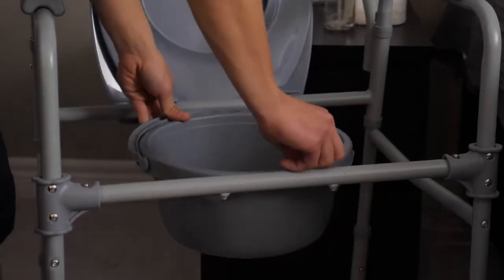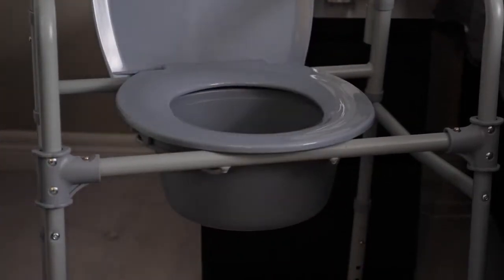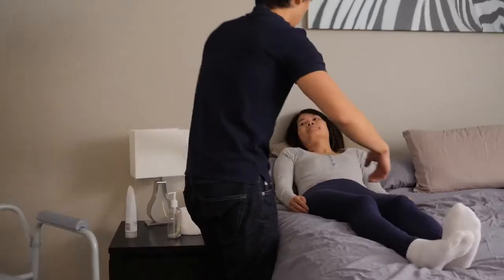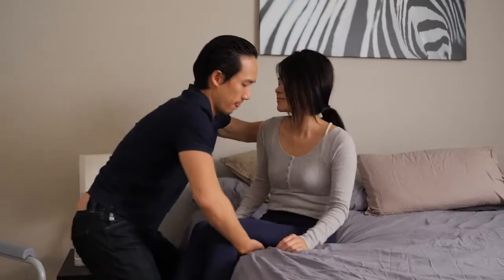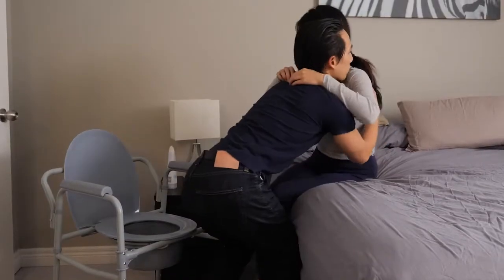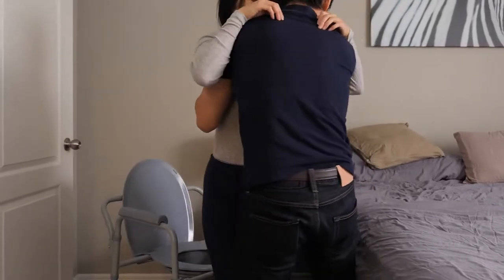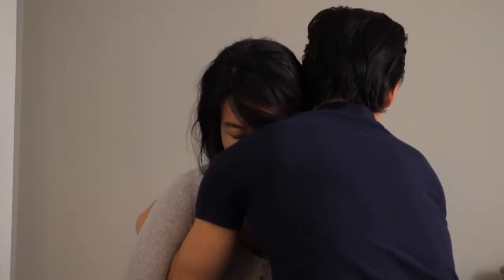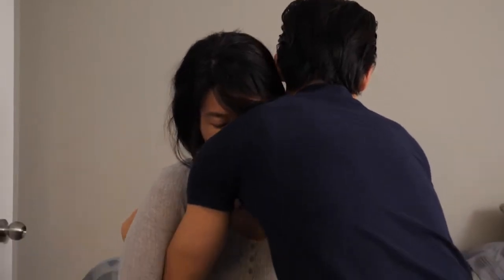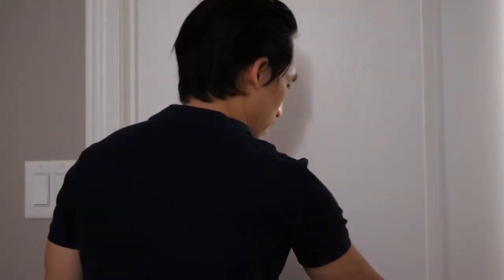To use a commode, make sure the pot is in place and put the commode at their bedside, making sure the brakes are on the bed and commode if they have them. From here, assist the person you're caring for to transfer from the bed onto the commode chair, and assist them to lower their pants while they're standing. Click here to see a video of how to transfer someone safely.